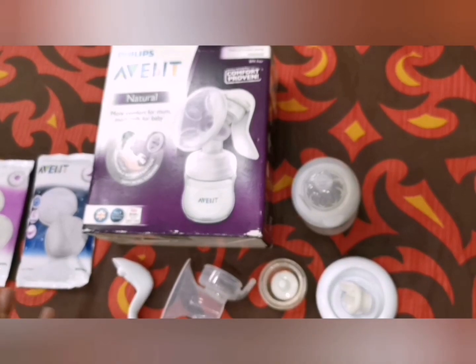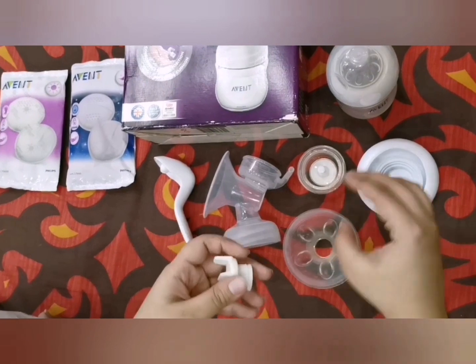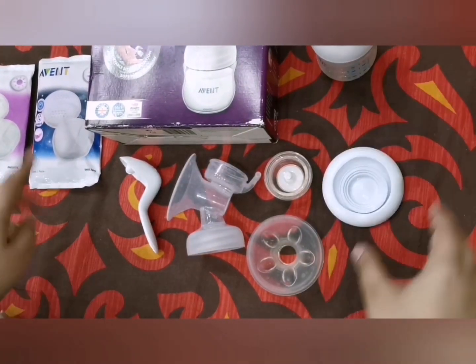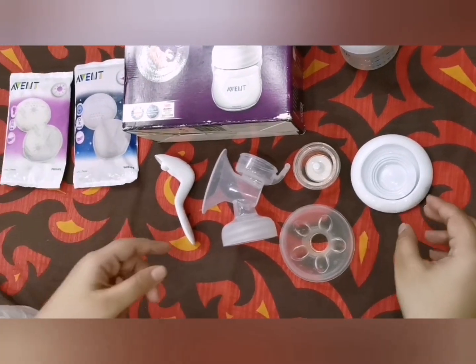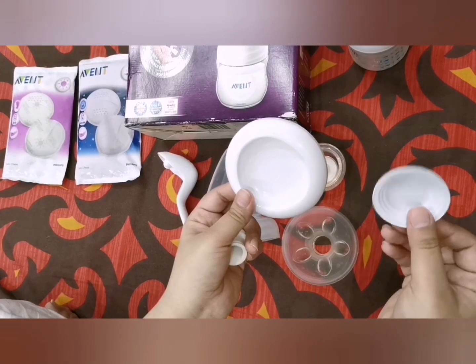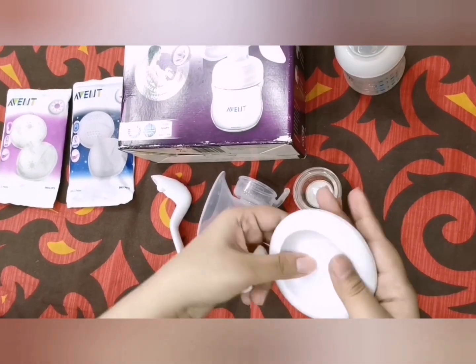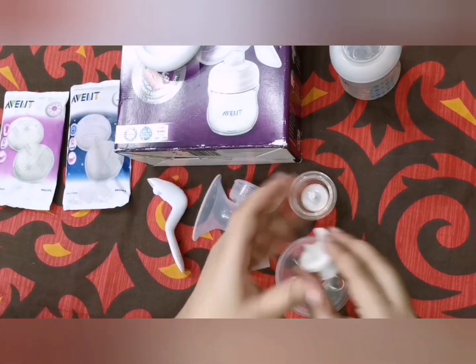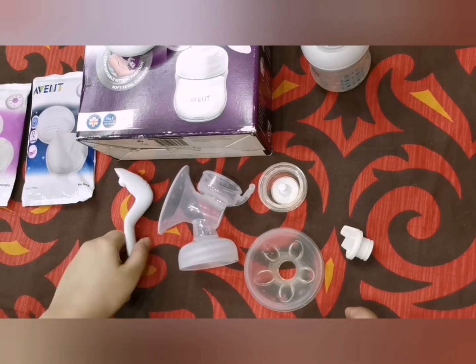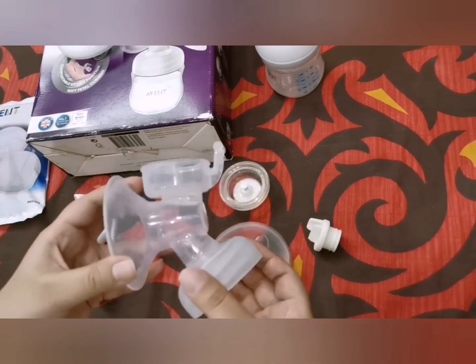Now let me show you how to assemble this breast pump. This is the four-ounce bottle that comes with it. These are the breast pads — day and night. There are two caps: one is for sealing and storing milk, and the other is for covering the bottle for feeding. Now let's look at the actual parts of the breast pump.